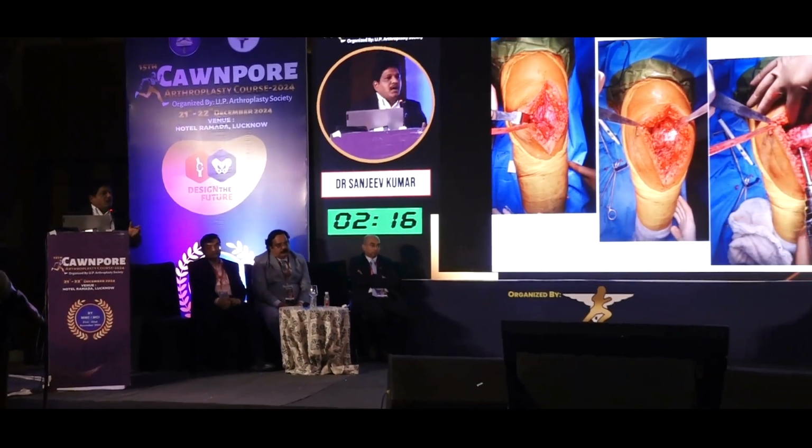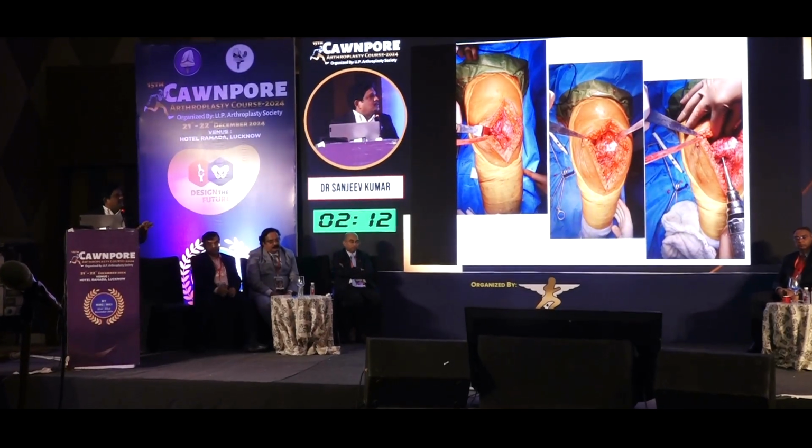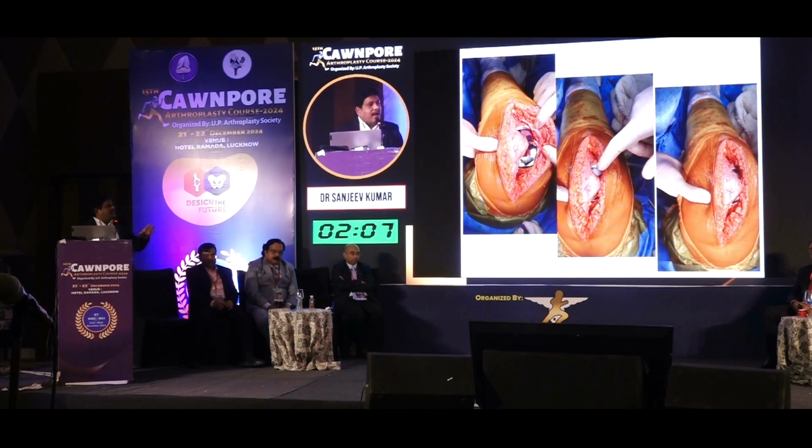And after all releases, we were not able to get adequate flexion so that we could put our jigs. So we started with doing the distal cut first. And after this cut, we did our knee in a standard manner. But after putting in our implant, we saw that the patella was not tracking correctly. So we needed to do a lateral patellar retinacular release. And after these releases, we were able to get assisted central tracking of the patella, and we are happy with this tracking.